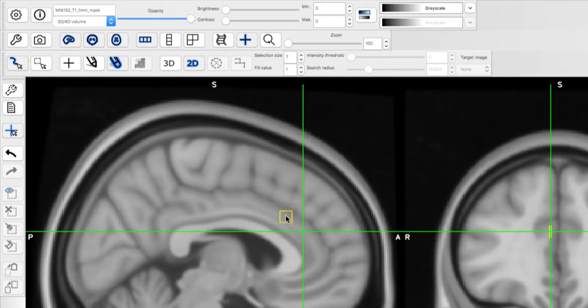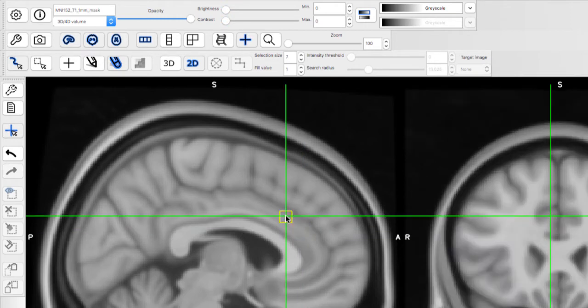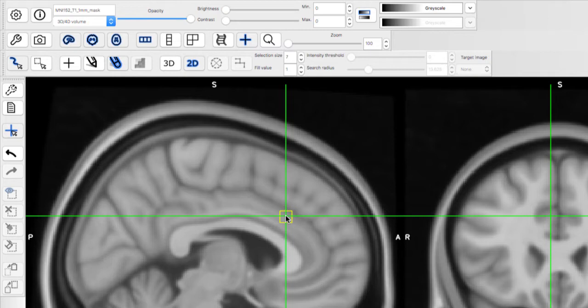Using Select Mode is more flexible. This lets you select voxels and then decide whether to fill them in, undo your selection, or remove the voxels that are highlighted.